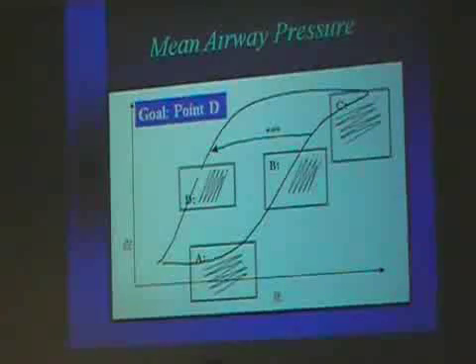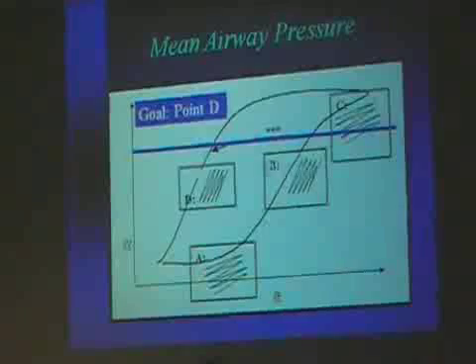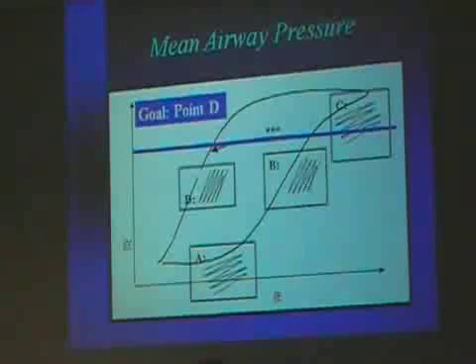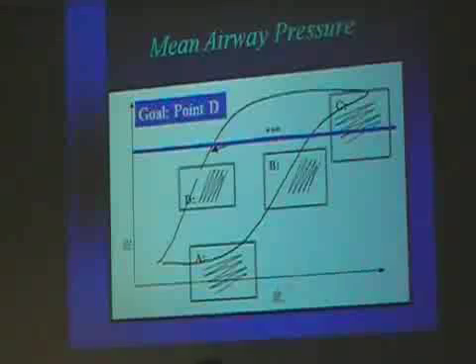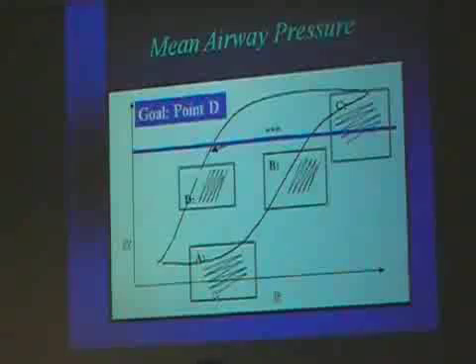As you come down on the expiratory limb, what happens is, you see that you get the same compliance on the descending limb of the pressure volume curve at a much lower pressure. Here, I'm out at a pressure of whatever, call it 20. Here, I'm getting the same exact volume, but at a much, much lower pressure.